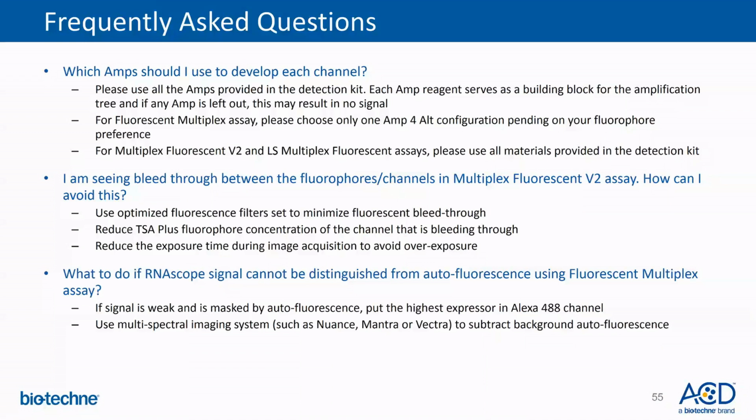For the fluorescent multiplex assay or the V1 assay, please choose only one AMP4 alt configuration depending on your fluorophore preference. For the multiplex fluorescent V2 and the LS multiplex fluorescent assay on the automated Leica platform, please use all materials provided in the kit.